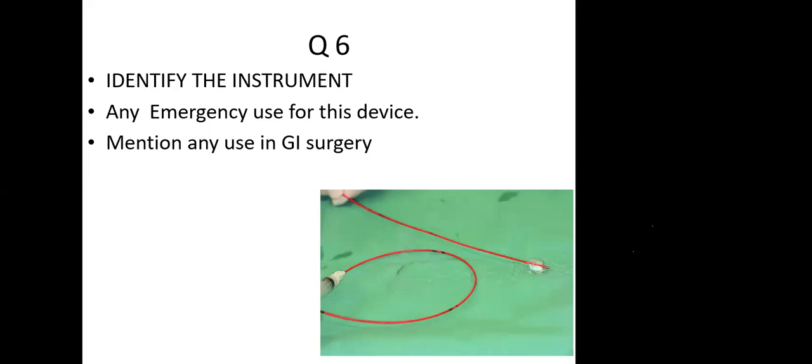Sir, towards the iliac side first, sir. Well, iliac side, because iliac does not have any clots, but yes, people do it that way because at the site of trauma or thrombosis, there can be a clot and that can go distally. So you will do that towards the iliac side, put a clamp, and then do the distal embolectomy, take out the clot, then release the clamp and go.